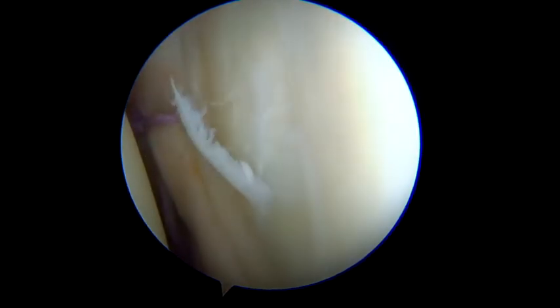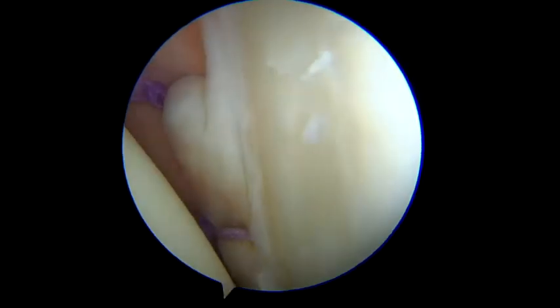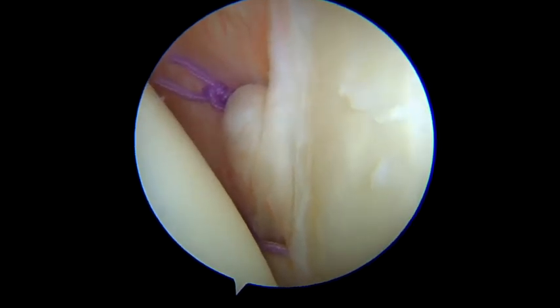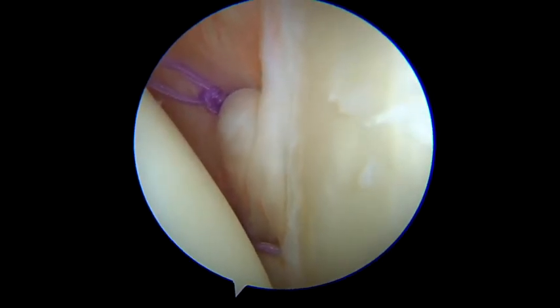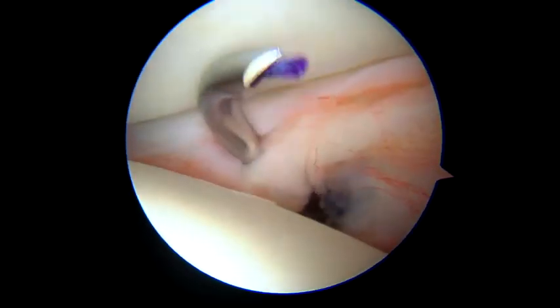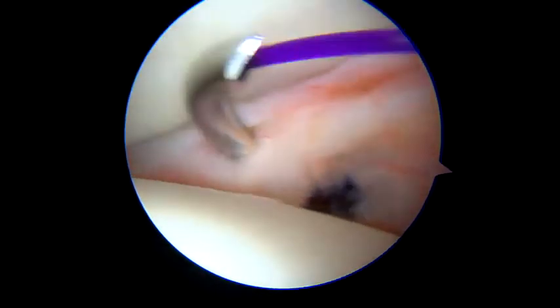We do not recommend performing a rotator interval closure nor abusively reducing post-operative range of motion. Passing the arthroscope through the anterior portal, it is then possible to introduce a cannula through the posterior capsular tissue. The first posterior capsular plication is initiated right next to the posterior portals at the 7 o'clock position.